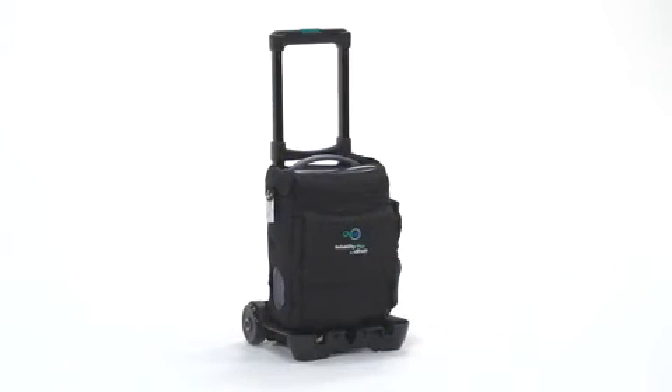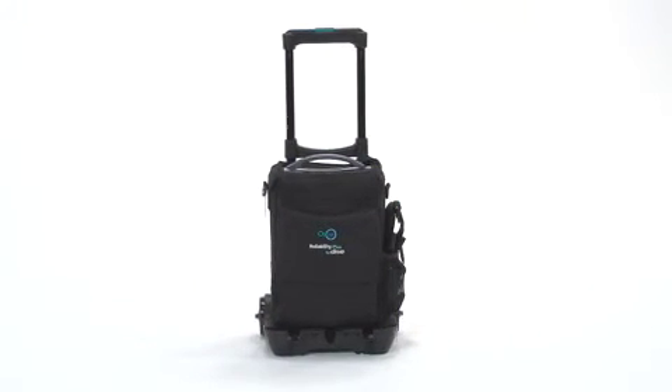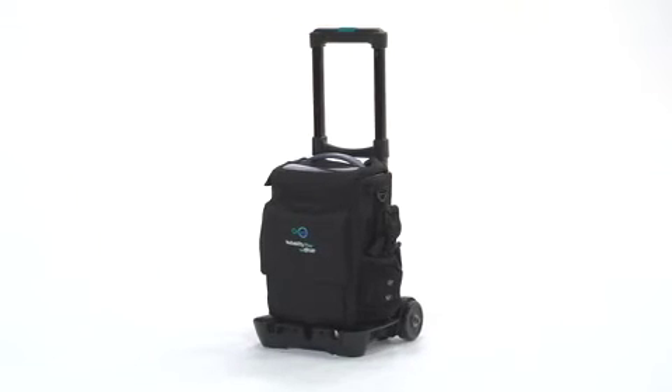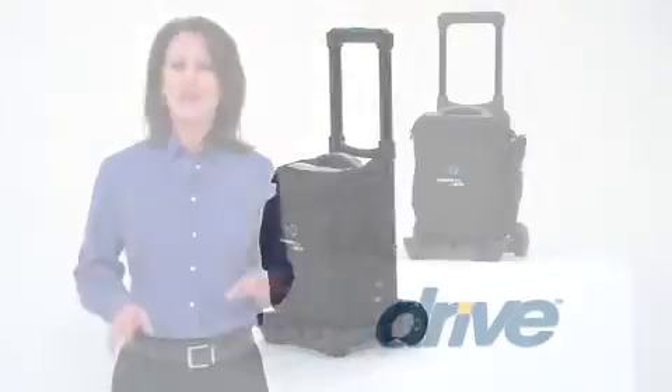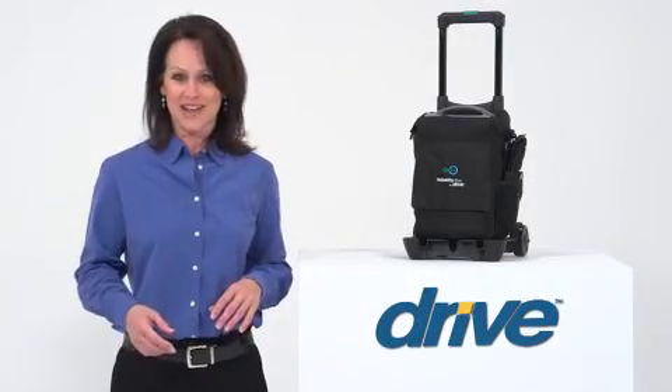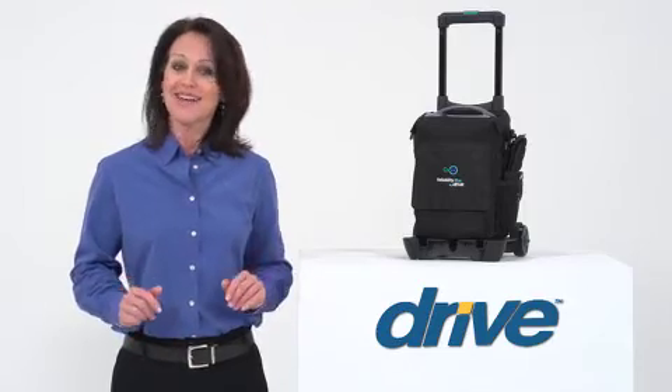If you're looking for a reliable, clinically effective, and cost-effective portable oxygen concentrator, the Oxus Reliability Plus is the right choice for you. You can always count on Drive Medical to bring you convenient and innovative lifestyle solutions, now and for the road ahead.